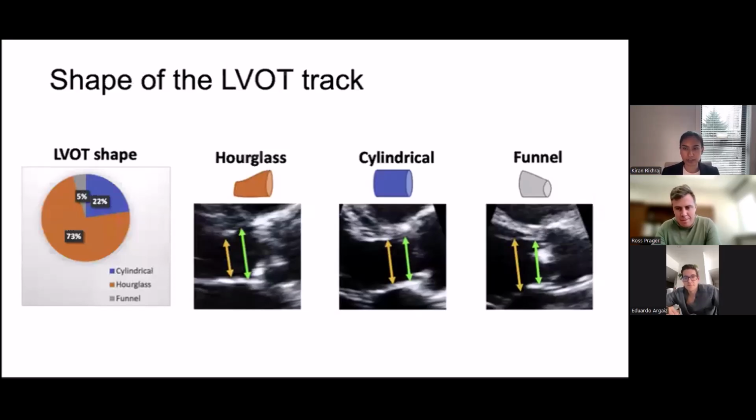There's a lot of literature, there are a lot of videos out there on what an appropriate envelope is and how to measure it, et cetera, et cetera. So do your patients that service, do yourself that service in getting good at it, and then you can go forward and rely on those numbers and make adequate clinical decisions.